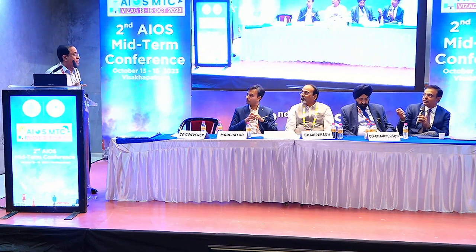Okay. So whenever you are not able to measure on the Lenstar, I take the patient to the IOL Master. And then, of course, in certain cases, you have got no choice but to do the manual. No, I mean, if you wanted to use something like a Synergy and you're not getting axial length on any biometer, because there are two situations. Synergy is not available less than 5 in any case. So, no, I mean opaque cataract, sir. Like, in your patient, you had a manual entry for the axial length. There is absolutely no problem, absolutely, because all of us have got LASIK available to us.